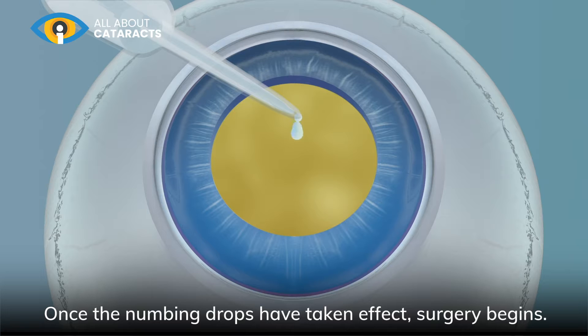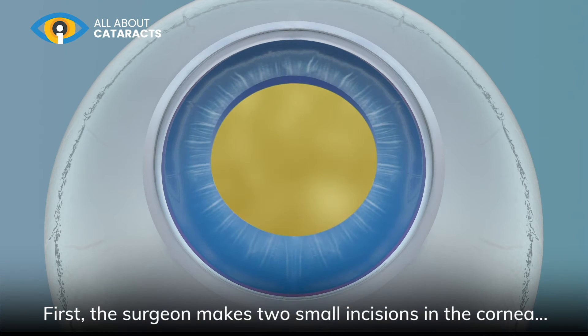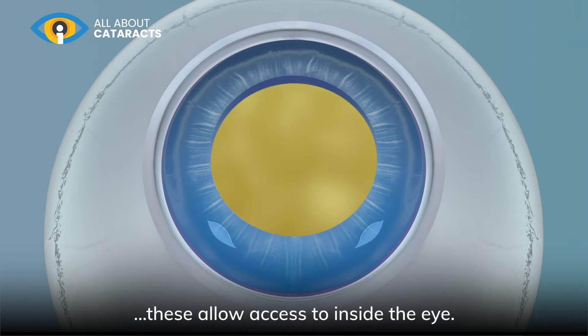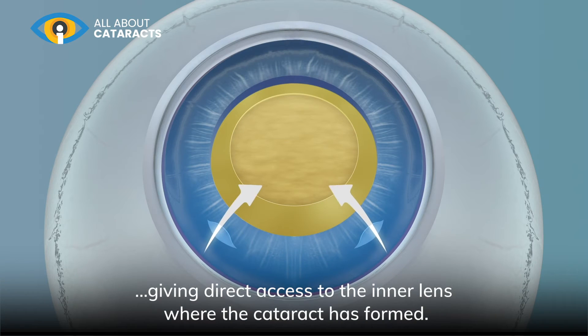Once the numbing drops have taken effect, surgery begins. First the surgeon makes two small incisions in the cornea. These allow access to inside the eye. The surgeon will then gently remove the top layer of the lens, giving direct access to the inner lens where the cataract has formed.